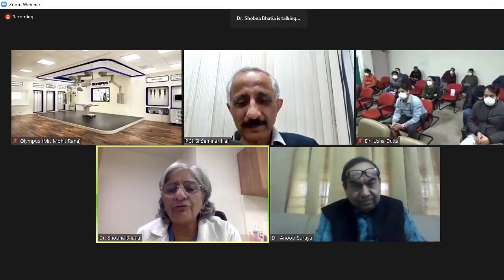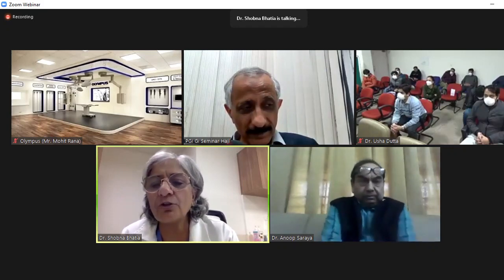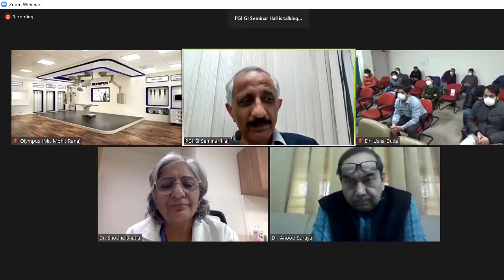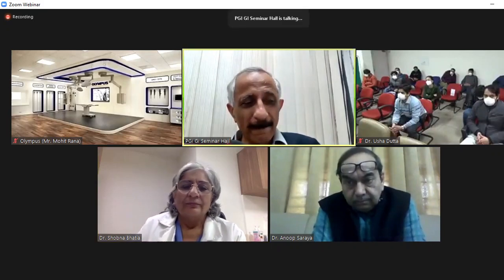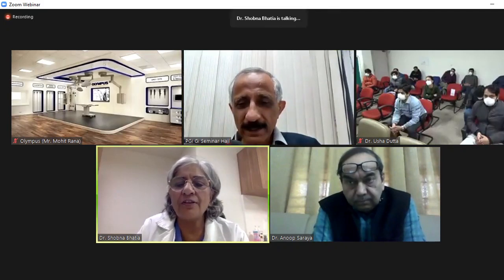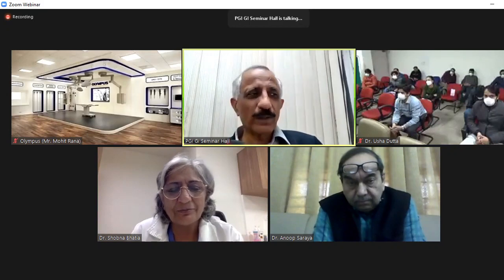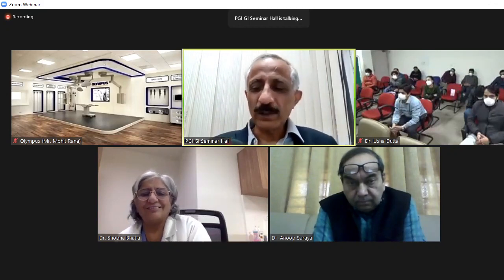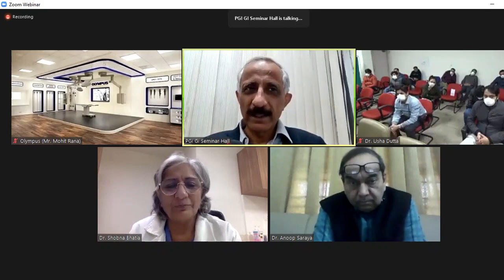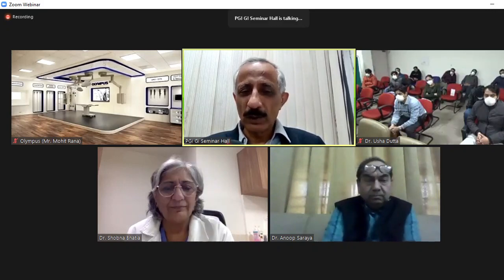Okay. How do you differentiate between a true and a pseudo diverticulum? This has come from Sumit Kumar Vagasia. I believe it would be for the esophagus. Okay. See, pseudodiverticula in the esophagus are very small, tiny, and appear on endoscopy as pinholes.